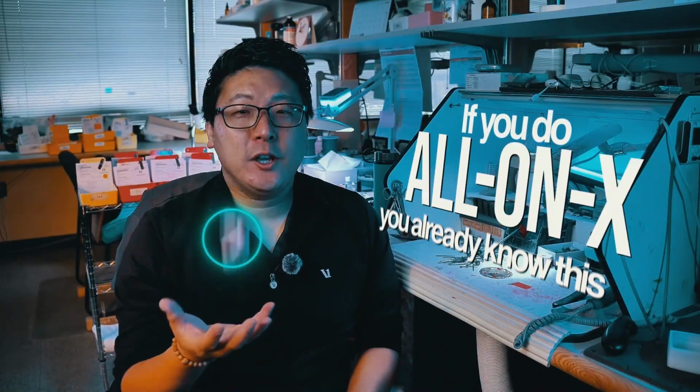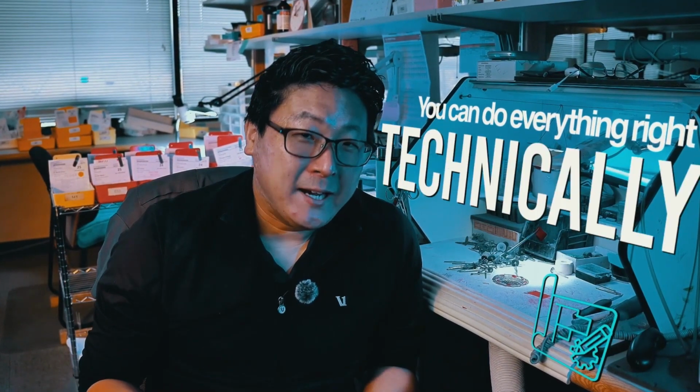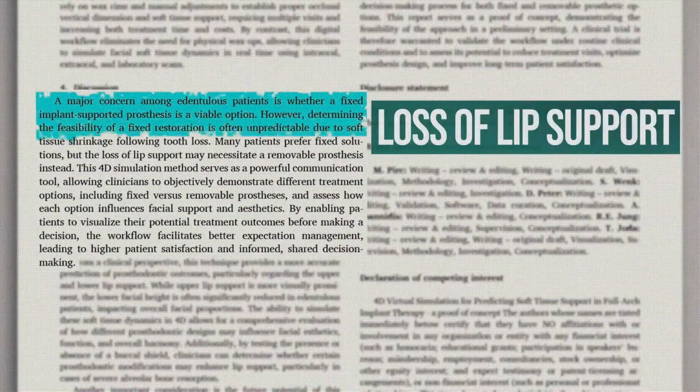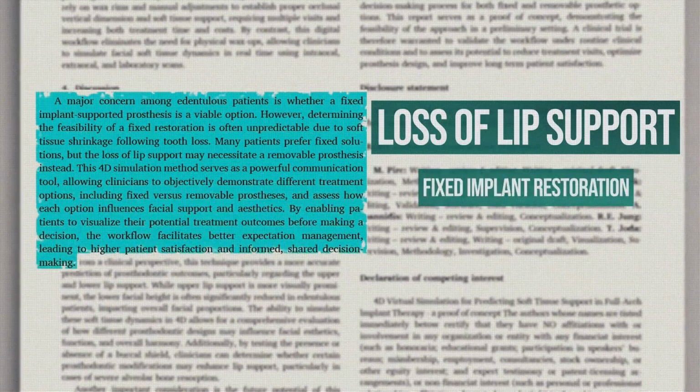If you do All-on-X, you already know this. You can do everything right technically and still miss the case because lip support was wrong. The paper actually states that loss of lip support can determine whether a fixed implant restoration is even feasible.